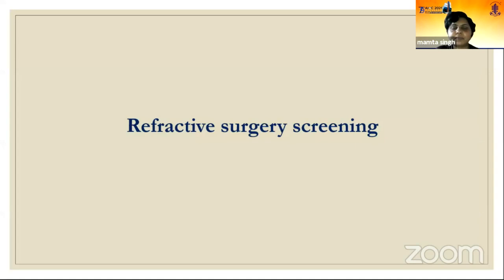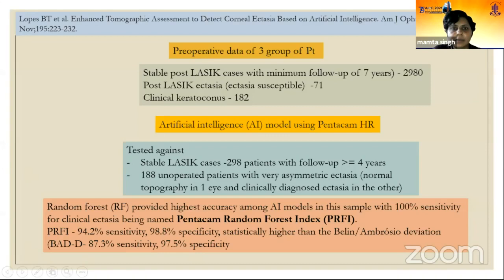Then comes refractive surgery screening. Based on Pentacam images, a particular index has been recommended now. That is the Pentacam Random Forest Index, or commonly known as PRFI. This has been proposed by Lopez in the year 2018. And this has been found to perform better, with better specificity and sensitivity, than the commonly used Belin-Ambrosio algorithm that we use very often.